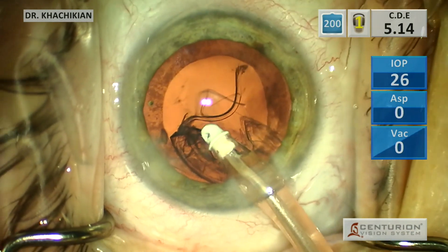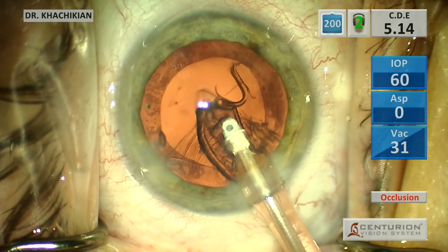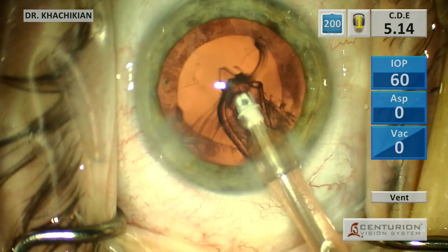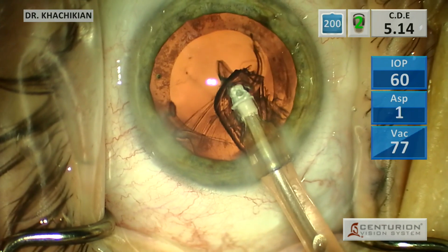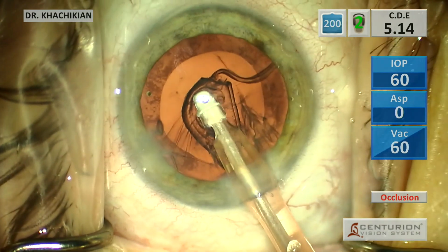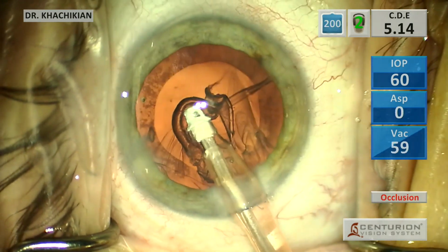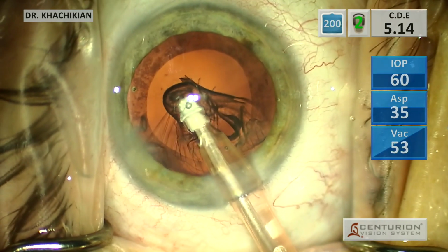This is the end of the case, and I'm pulling here on this last bit of cortex. If you look closely, you can see that I'm also pulling the posterior portion of the capsule, and it's transmitting into the equator. Just with that thin film of cortex, you're pulling the whole back because the zonules are loose in this section.